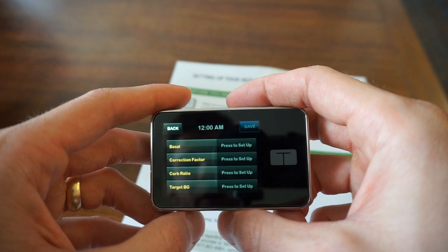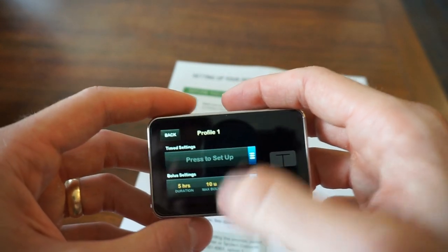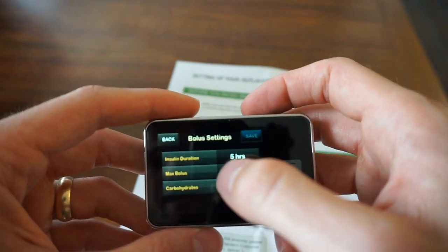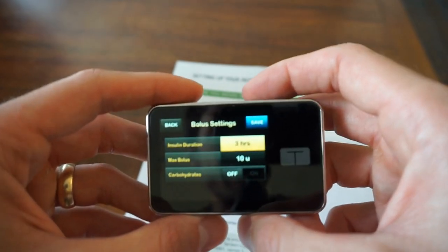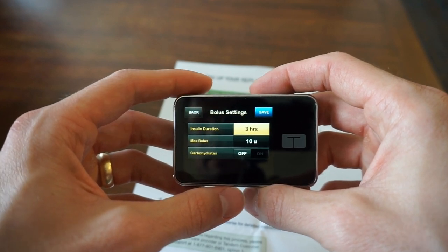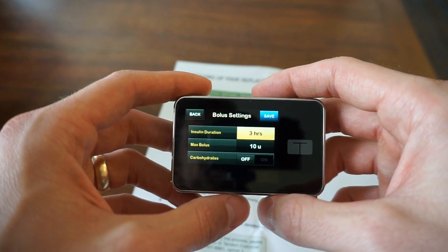Going into Bolus settings, I'm going to adjust insulin duration. Through testing, I found that my insulin duration is about three hours, so I'm putting that in. This varies person to person — some people have four, some people have five. When I was first diagnosed, they told me two. It's going to have to be tested on your own; we talk about how to test that in our programs and it's pretty easy once you figure it out.